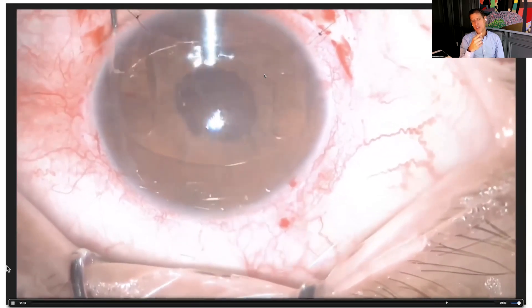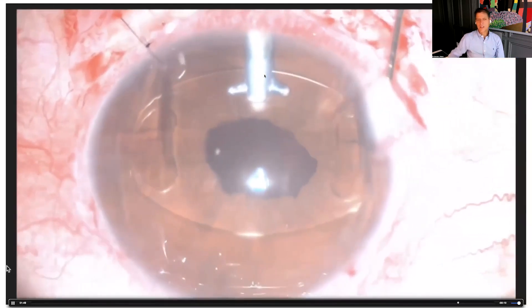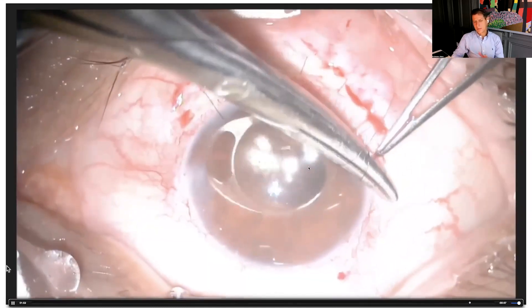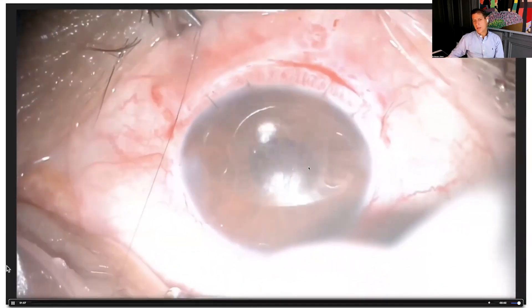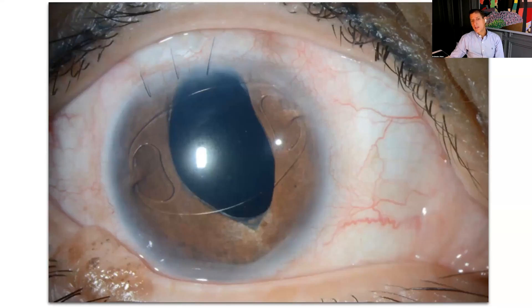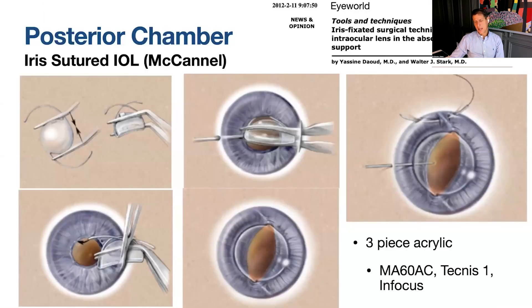The fixation forceps that comes with these lenses stabilizes the optic so we can perform the enclavation. Even in complex cases with some capsular remnant and imperfect iris, if the lens sits well and the cornea is adequate, we can complete the enclavation. That covers the anterior chamber IOL options.